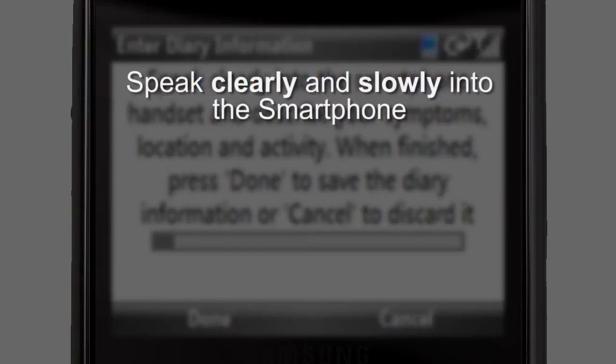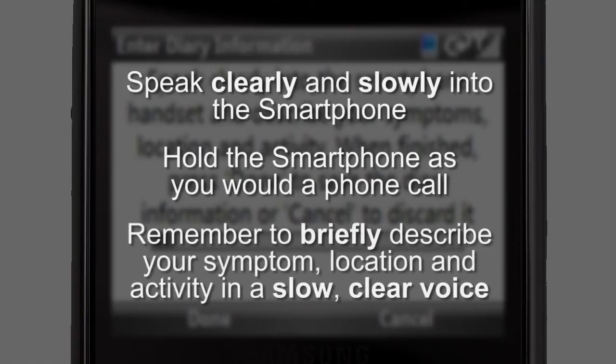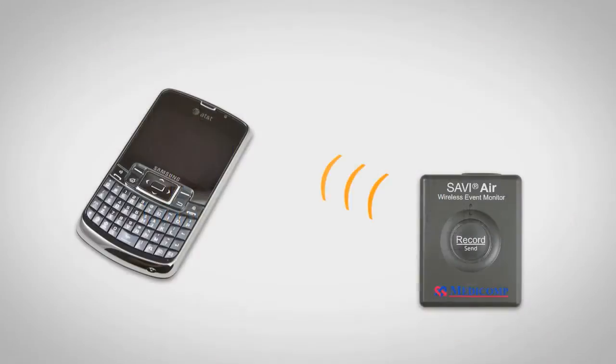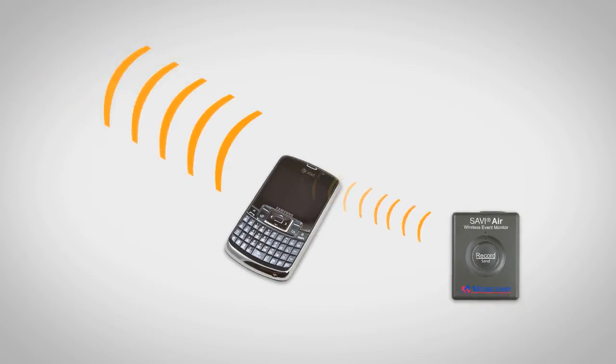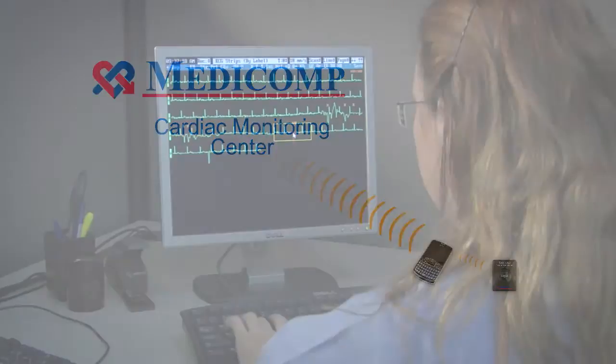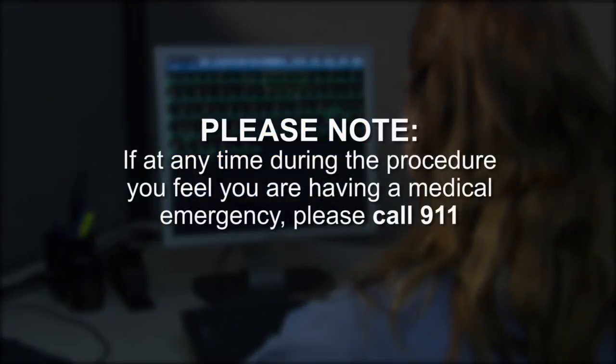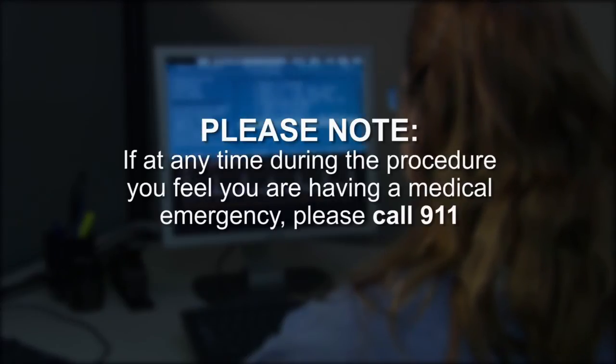Speak clearly and slowly into the phone, holding it in the same manner as you would if placing a phone call. Please remember to briefly describe your symptom, location, and activity in a slow, clear voice — for example: 'Skipped heartbeat, watching television at home.' When you have finished your voice recording, press Done with the left soft key. The MediComp smartphone will send your ECG recording to the Cardiac Monitoring Center via the cellular network whenever you press the Record Send button. It is not necessary for you to call the CMC to send your recording. Please note: if at any time during the procedure you feel you are having a medical emergency, please call 911.